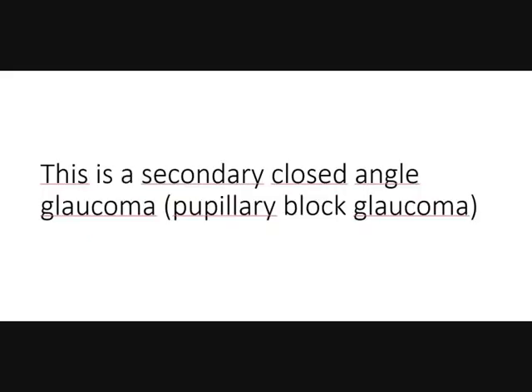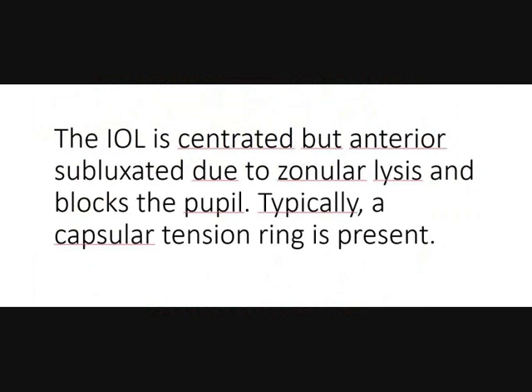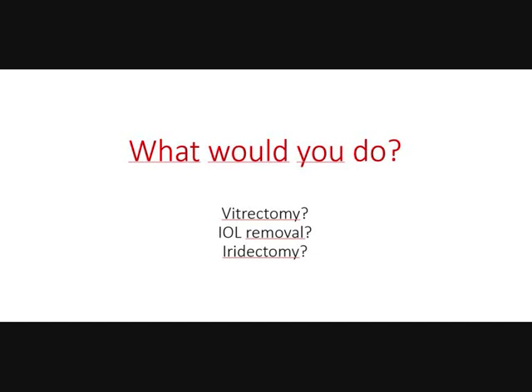The diagnosis is a secondary closed-angle glaucoma, a pupillary block glaucoma. The aqueous flow is blocked and the IOL is pressed against the pupil. We have a flat anterior chamber. The IOL is centered but anteriorly subluxated due to zonular lysis, and blocks the pupil. Typically, a capsular tension ring is present. What would you do? Vitrectomy, remove the IOL, iridectomy.